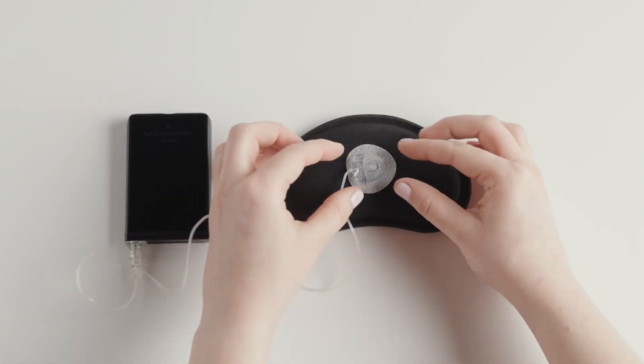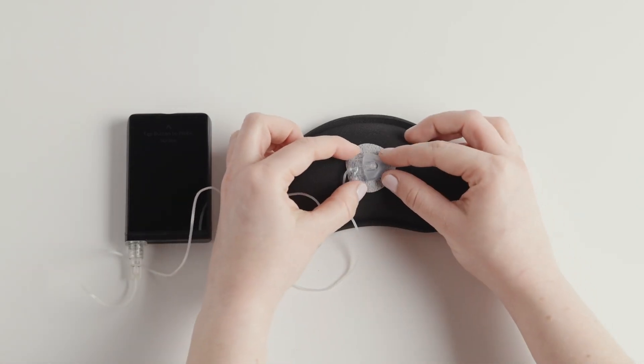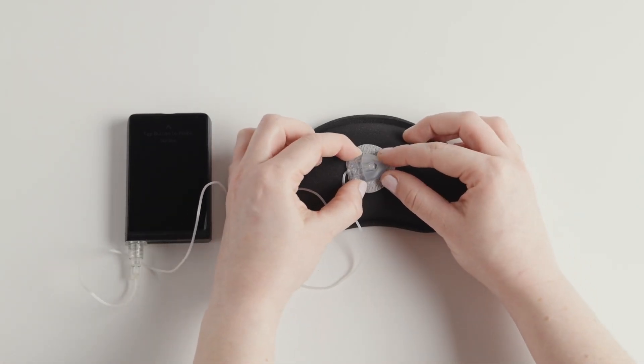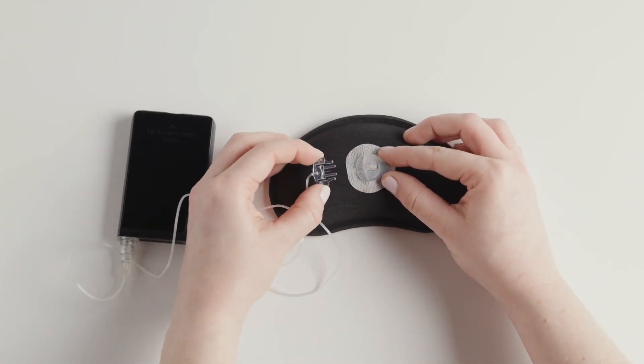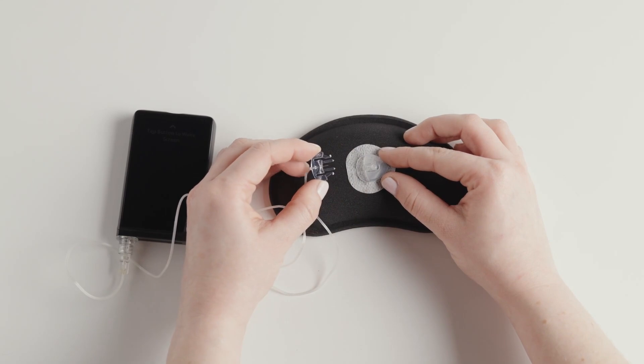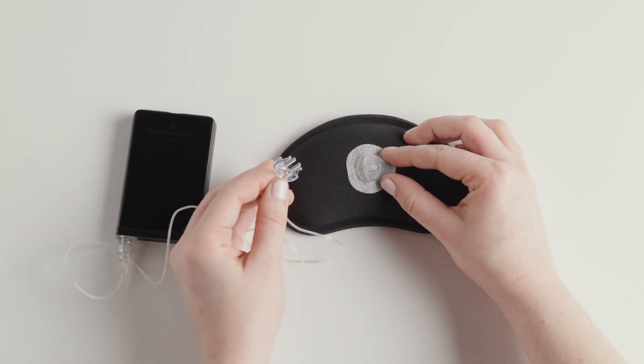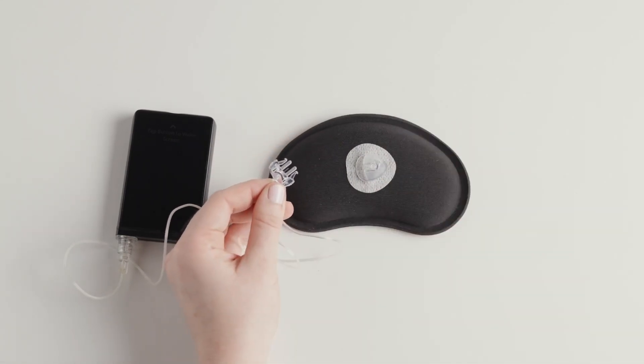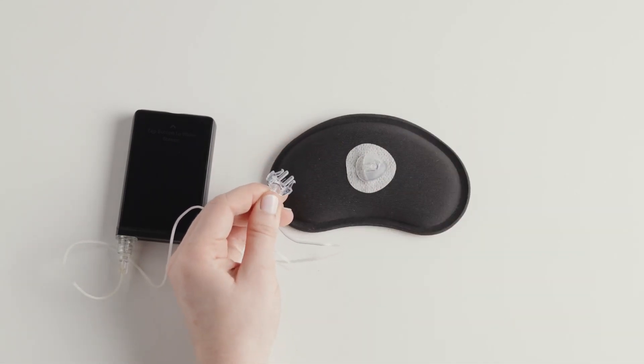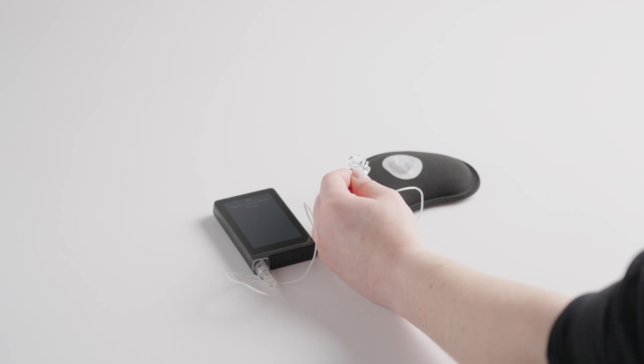To disconnect from the infusion set base, gently pinch the two sides of the end of the tubing together and pull straight. Be careful not to pull on the infusion set base itself.